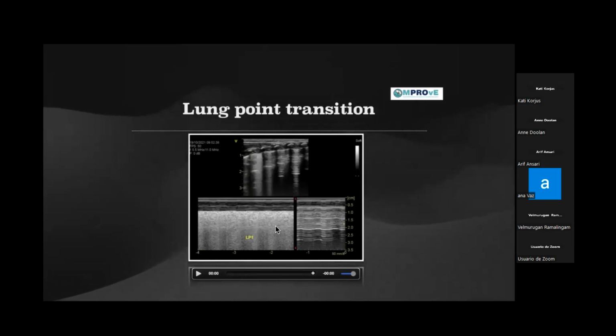This is a transitional zone. So you get both the areas in the same picture. It becomes easy to compare. It becomes comparative here. Is it making sense?